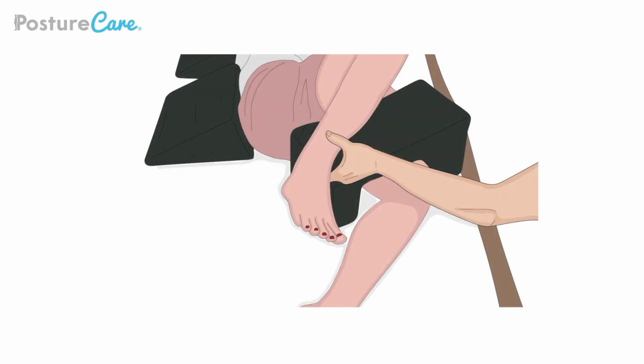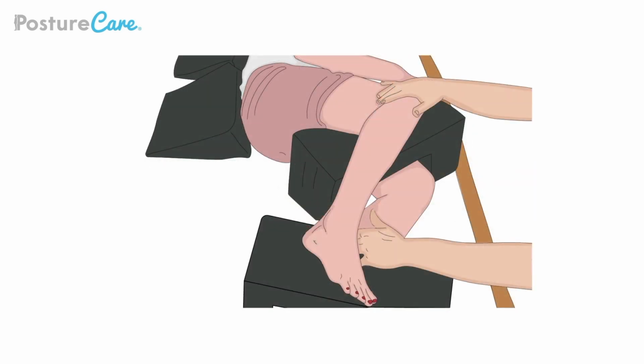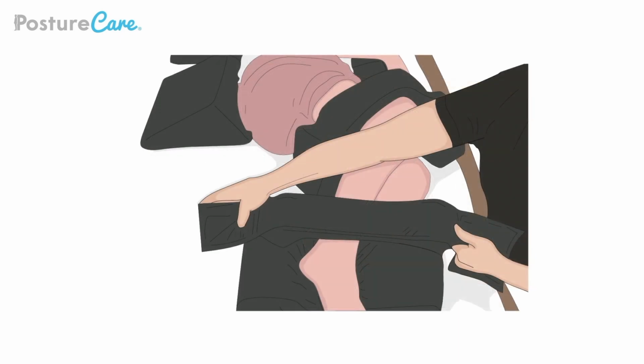If the patient can lift their own legs high enough to place a bridge under each leg, then please encourage them to do so. Alternatively, please assist the patient to lift their leg whilst employing the correct manual handling procedure. Once the bridge supports are in place, secure with the Velcro straps as shown. The straps are there to support and maintain the optimal position. You will notice that your client should now have airflow between their legs. The top hip is neutral and the knee and foot are well supported.